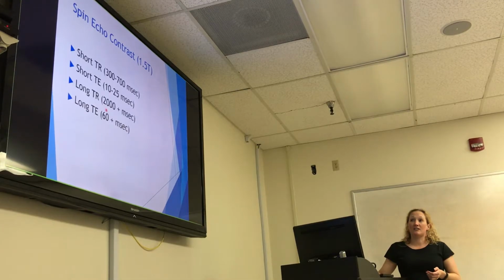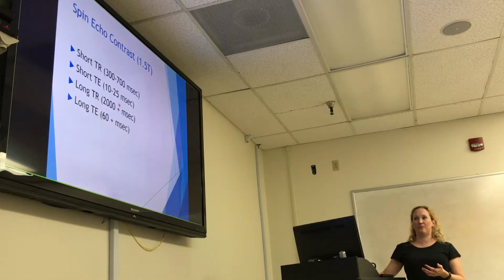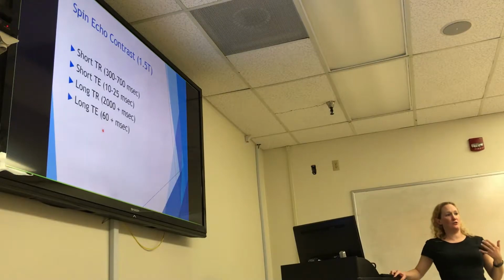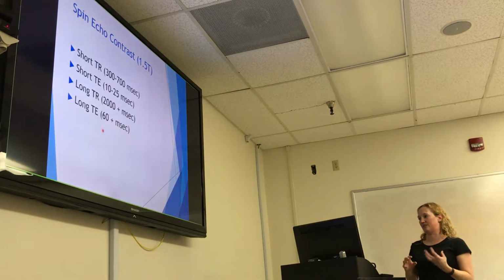So here we have our long TR, 2,000 plus milliseconds. And our long TE is anything above 60. Again, you can see there's a very broad range in these two different parameters, because T2 happens a lot faster than T1 relaxation. That dephasing happens very, very quickly.